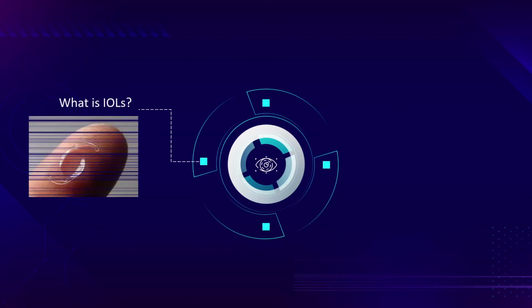To take the place of the clouded human lens, a precisely engineered artificial lens called the intraocular lens, or IOL, is implanted into the eye at the time of cataract surgery. Unlike a contact lens, it is permanently fixated inside the eye. Then, where is the IOL being used?